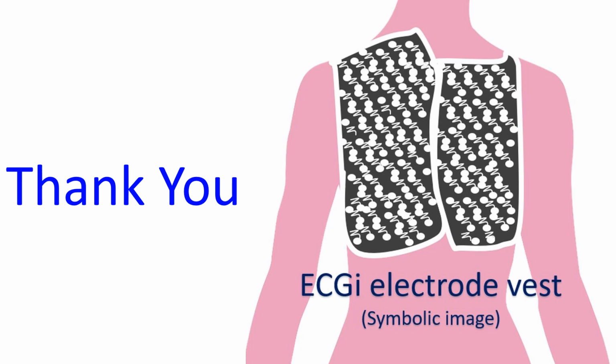One of the latest advances is ECG imaging, ECGI, which uses a large number of chest electrodes worn as a vest. ECGI can give various types of maps of the electrical activity of the heart, like a similar mapping using multiple electrodes within the heart, but non-invasively. These images are integrated with computed tomography, CT images of the heart, to give valuable information.